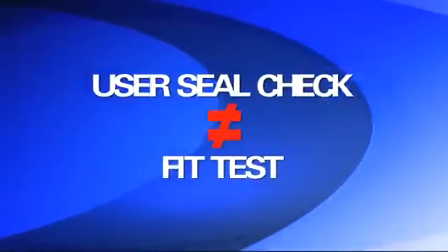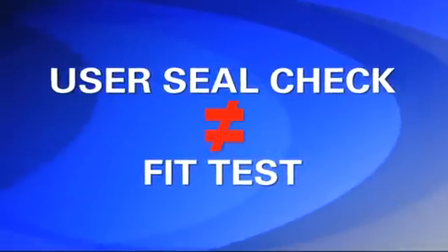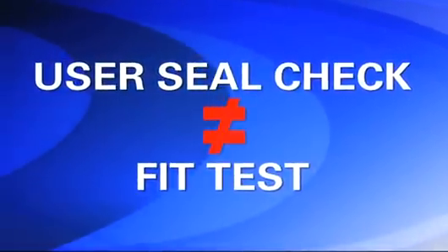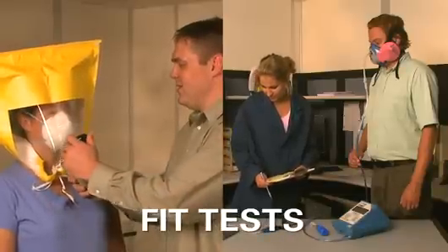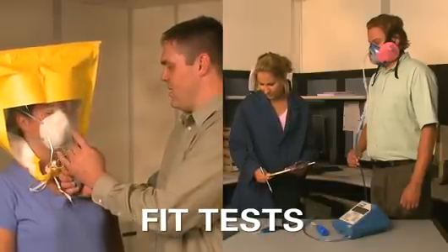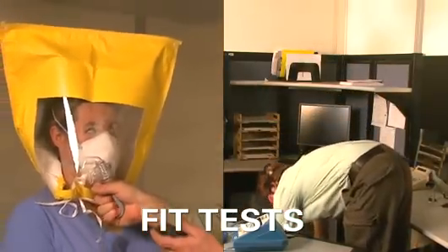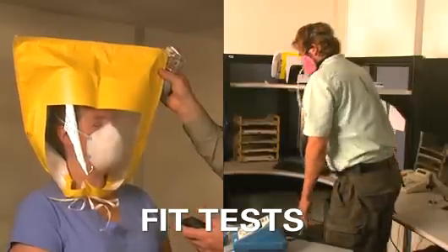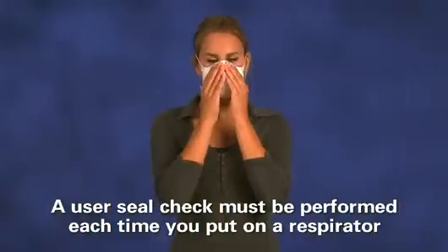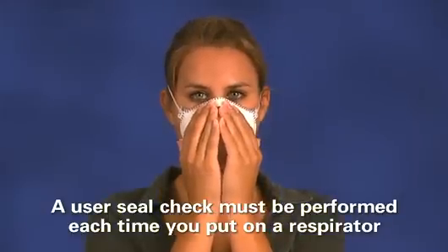Sometimes workers confuse the term user seal check with the term fit test, which is different. A user seal check is not a substitute for a fit test, which is a more involved process that uses a test agent or instrument to verify the respirator's fit. A fit test must be performed before you wear a respirator for the first time and at least annually thereafter. A user seal check must be performed each time you put on a respirator to check that it has been donned correctly.